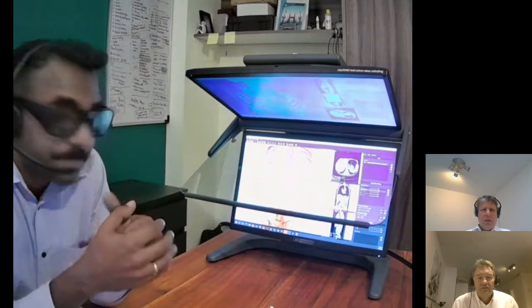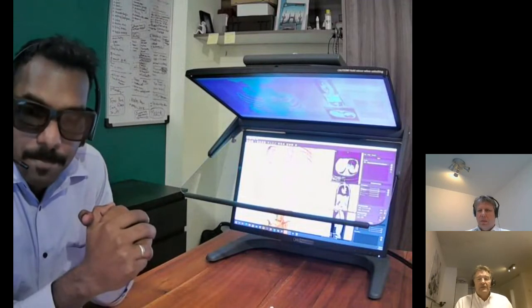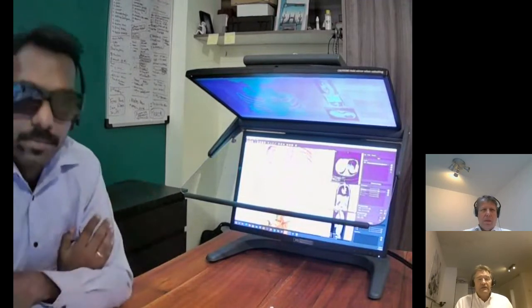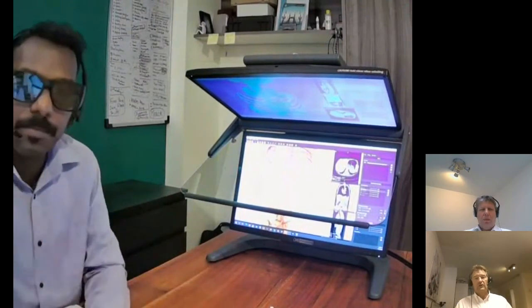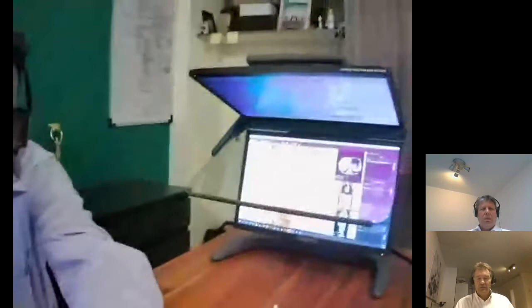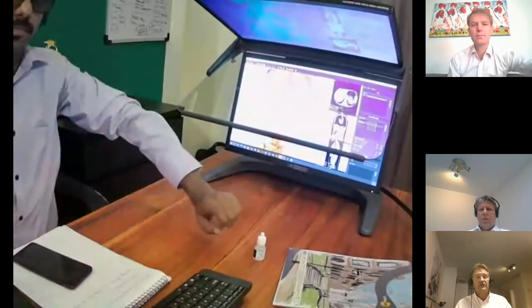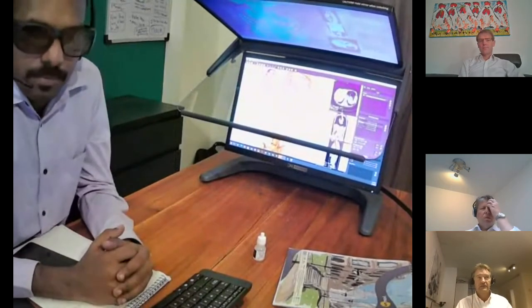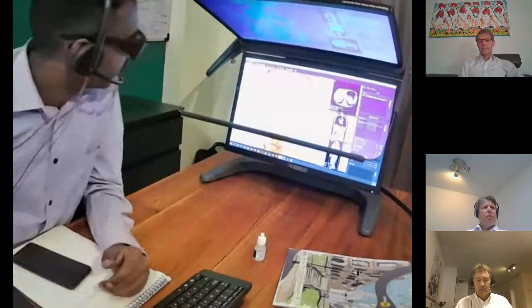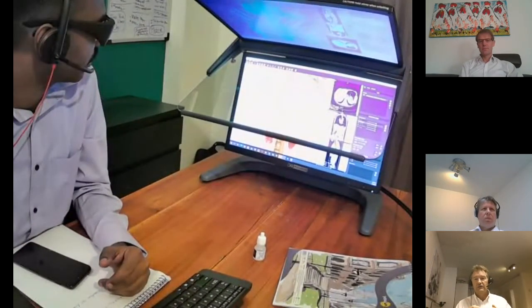If I may add to that, Srihari, it's a good point. Just from experience, we had customers that really wanted 3D printing and 3D printing only. There was one doctor who was very much involved, and he wanted 3D printing because he wanted to have a look at it. At some point, we created a 3D print, we gave it to him, but we also showed it within Vesalius on a screen.